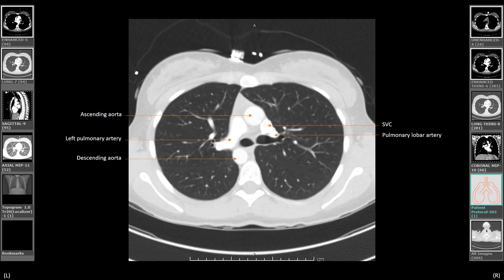Now as we enter the right main stem bronchus, anteriorly is the right pulmonary artery which branches out to superior lobar arteries following the right upper lobe bronchus, and down laterally along the bronchus intermedius, branching out to middle and inferior lobar arteries.